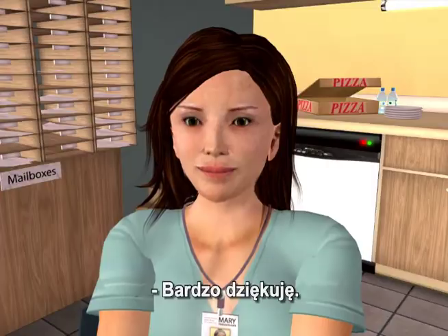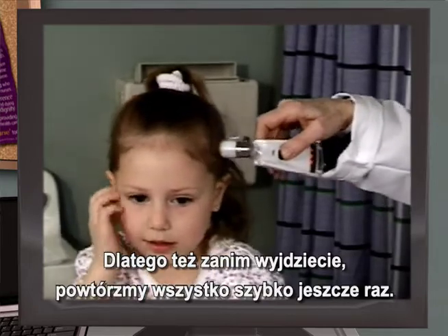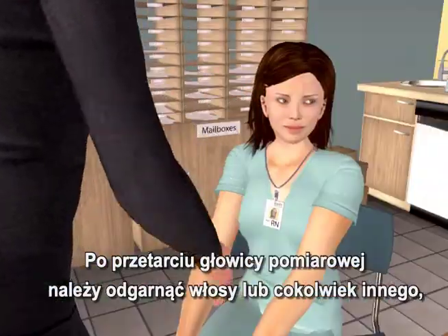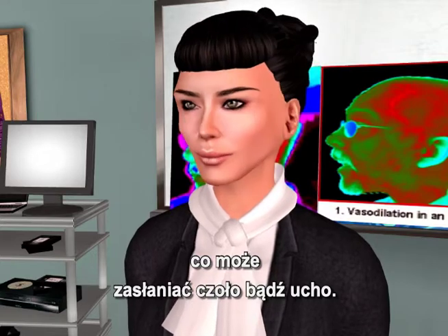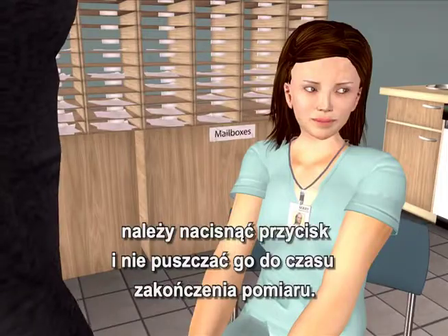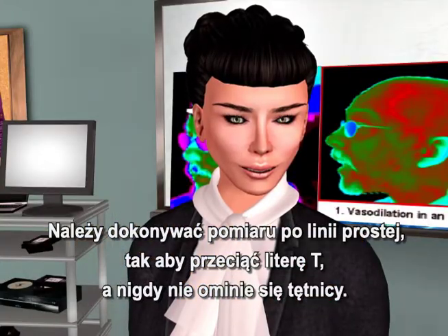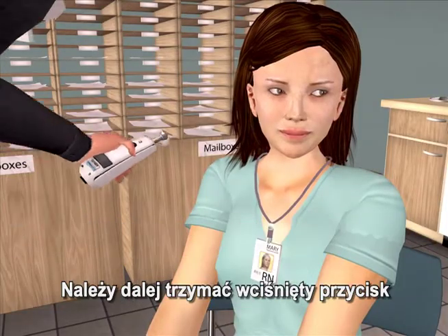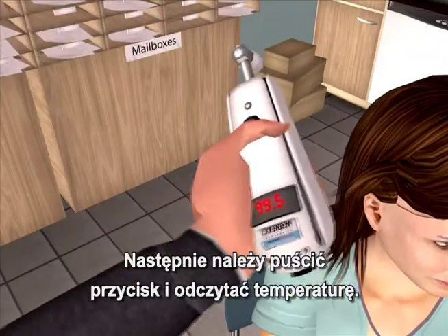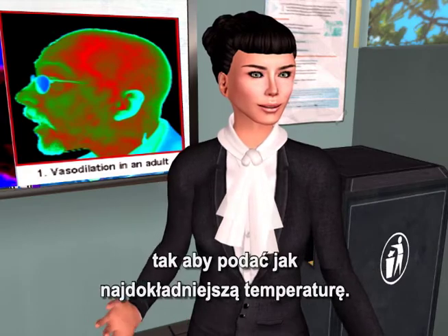It looks as if Exogen has thought of everything. Thank you very much. However, the most important thing to take away from this training is proper technique. So let's quickly review one more time. After wiping the probe head, brush away any hair or anything else that might be covering the forehead or the ear. With the probe flush on the forehead, depress the button and keep it depressed until you are done. Slide straight across the forehead, crossing the T's, not down the side of the face. Scan in a straight line to cross the T's and you'll never miss the artery. Continue to hold the button down, touch the neck behind the earlobe — the perfume spot. Now let go of the button and read the temperature. The temporal scanner pinpoints the highest of 3,000 temperatures to provide the most accurate temperature possible.